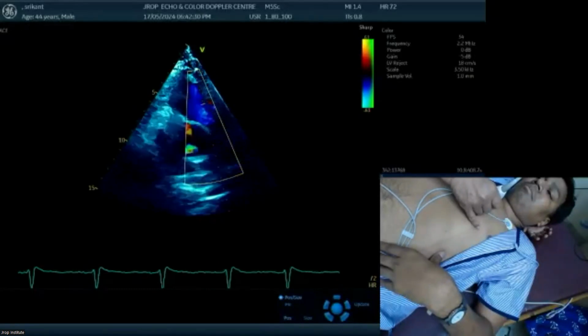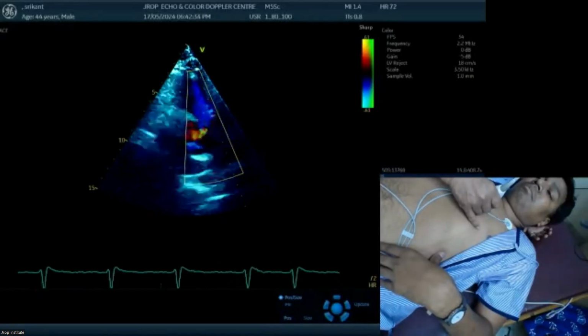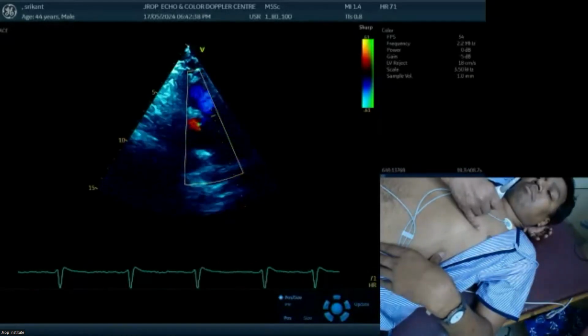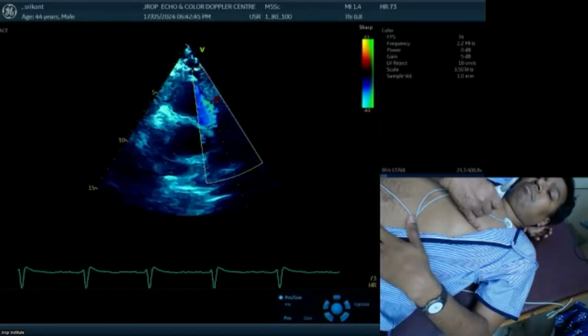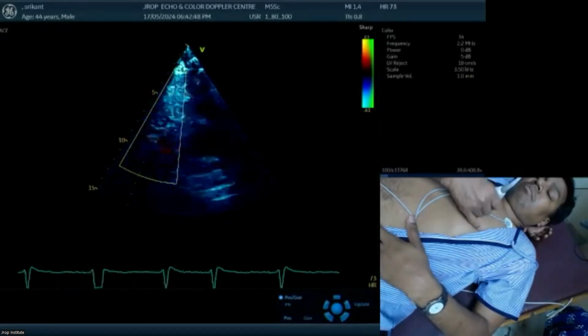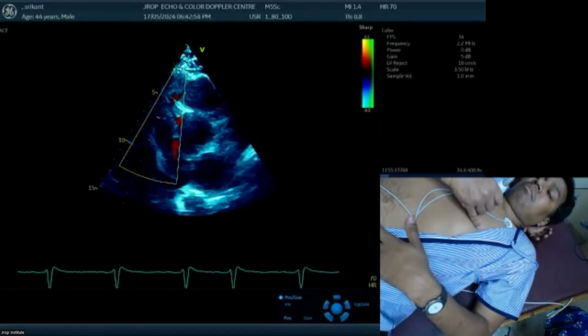Before the pulmonic valve is the RVOT. Distal to the pulmonic valve is the pulmonary artery flow pattern. This is a very important window for calculating pulmonic flow gradients and pulmonic regurgitation, and no other window is better except this one. On the other hand, you can see colors in the tricuspid valve leaflets.